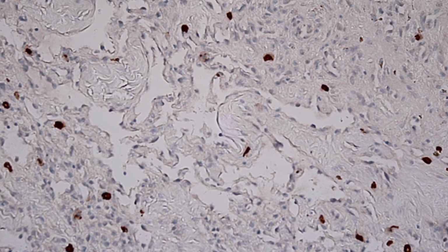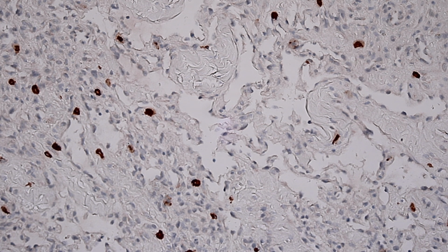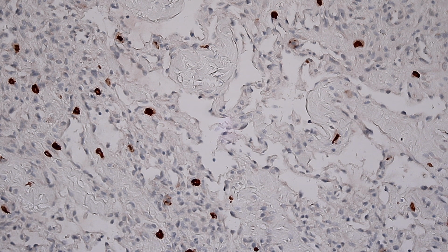So the MART1 issue is problematic because it sometimes can mimic focal invasion of the dermis in melanomas. If you're looking for invasive melanoma underneath an in situ melanoma, that MART1 can be problematic if it's staining the mast cells. I think the helpful thing there is looking in the deeper dermis and seeing that it's happening throughout the tissue, even away from the melanoma in situ. And also in lymph nodes, if you're using MART1 to look at sentinel lymph nodes for melanoma, when you have even scattered single cells throughout the node, always keep in mind, could these be mast cells?